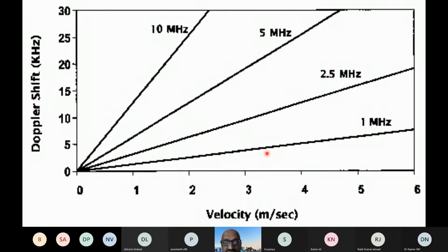So these factors are exactly opposite to that of two-dimensional echocardiography. This is called the paradoxes of Doppler. The first paradox is that Doppler works best when there is parallel echo beam orientation or alignment as compared to the flow of blood. The Doppler measurements are accurate when the echo beam is parallel to the flow of blood.